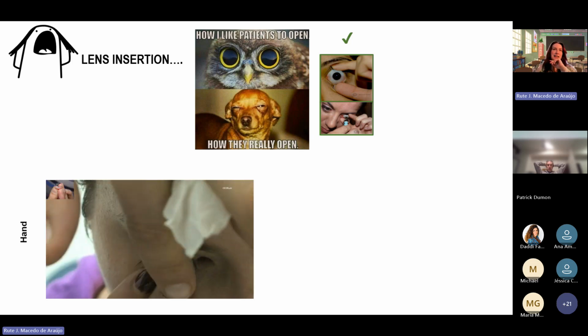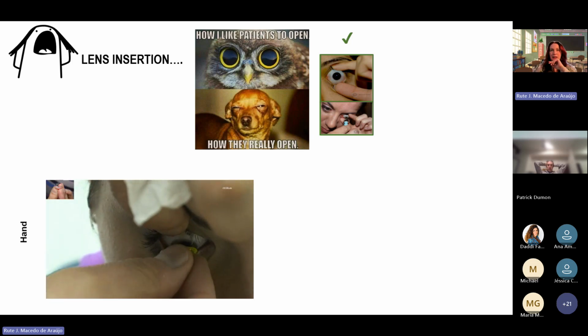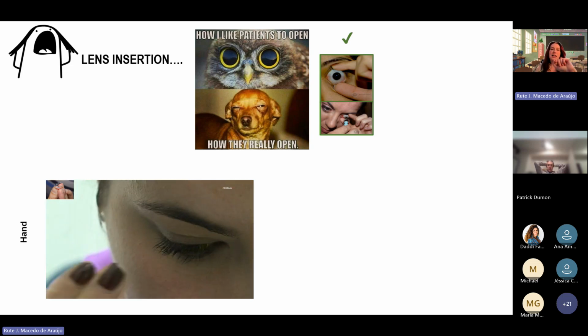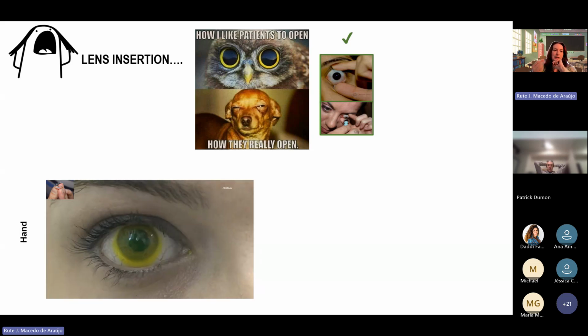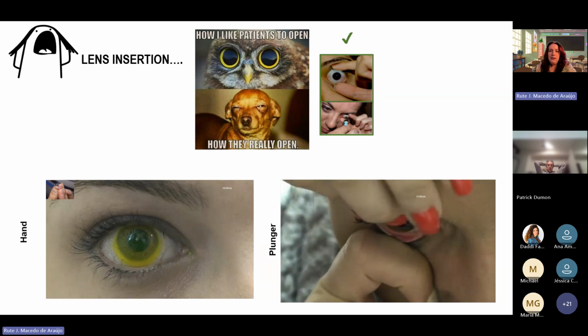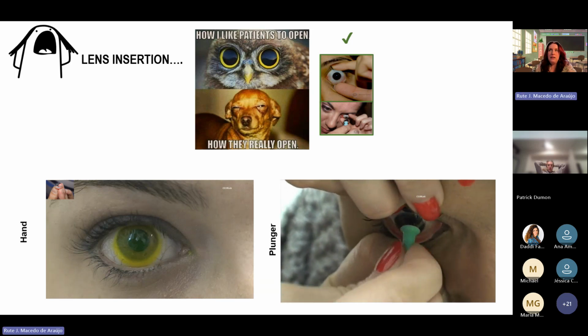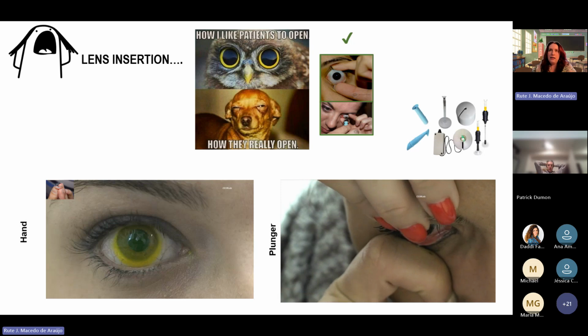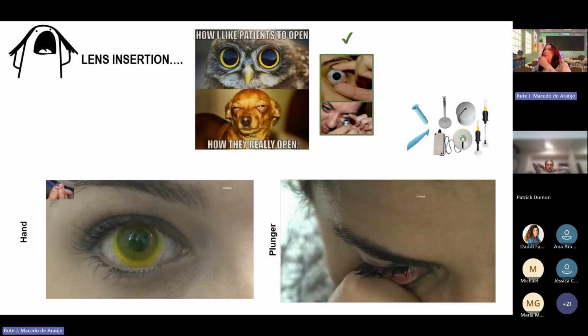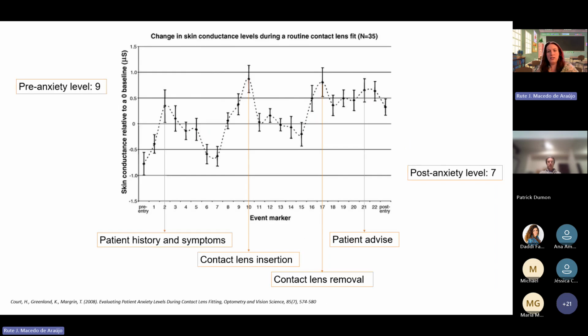So yeah, we need to educate the patient to open the eye correctly, and we can insert the lens either with this hands technique with a 3-finger, and the lens will be held so that the liquid that is on the lens does not fall, or with a plunger, as you can see here on this video. And there are, as we saw, a lot of things that could help in the insertion of the scleral lens. There are stands for the plungers, etc.